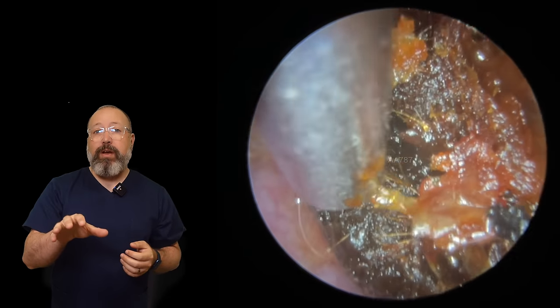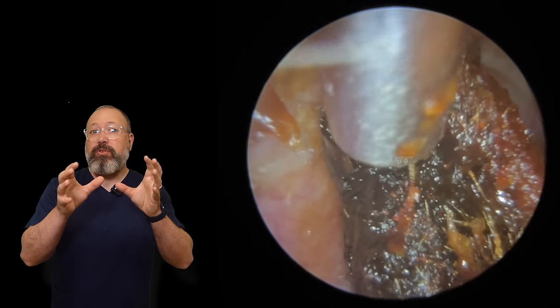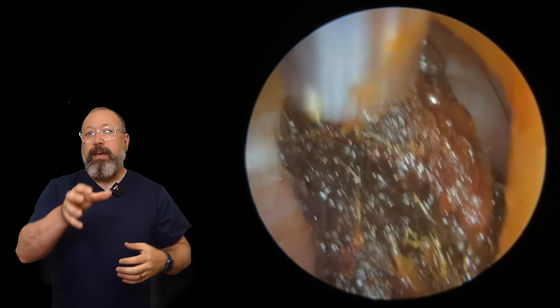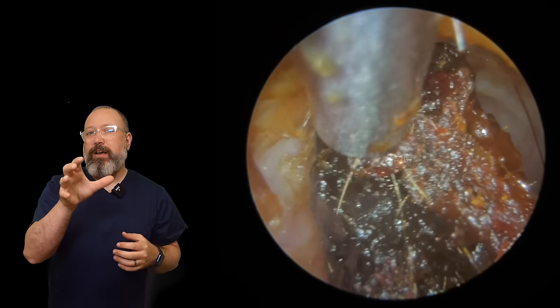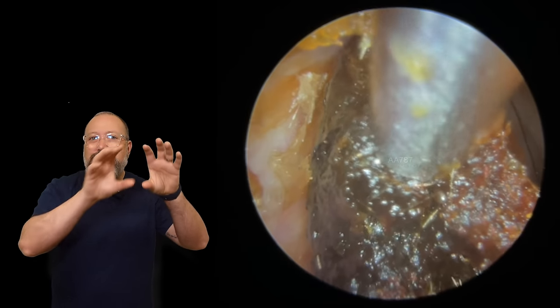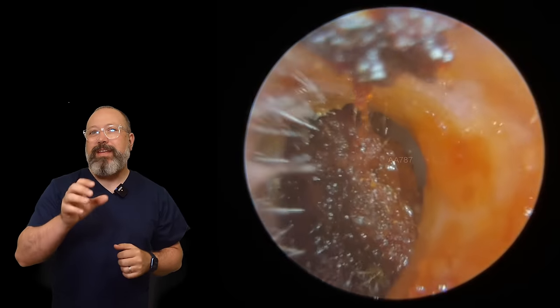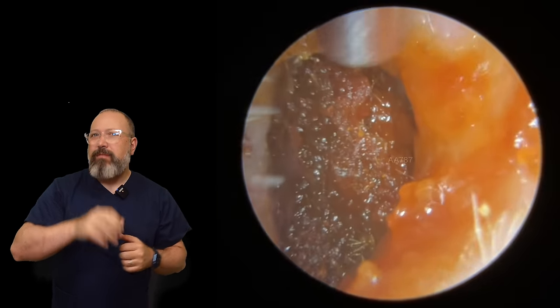We're just starting to get a little bit of movement to this wax now. You can see it's really starting to come away from the canal — we've got a grip and the whole thing just twisted slightly. You can see the color difference too: there's a darker section of wax, almost like a seam of darker wax running through this plug.